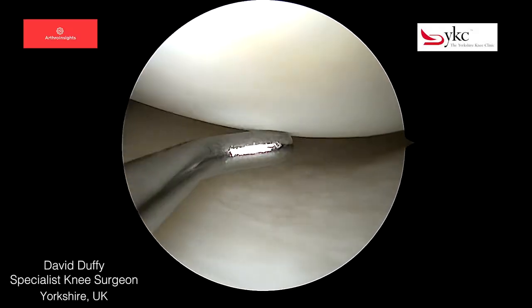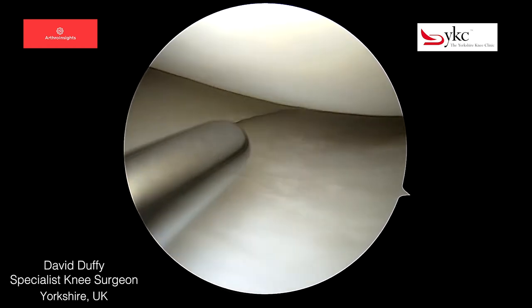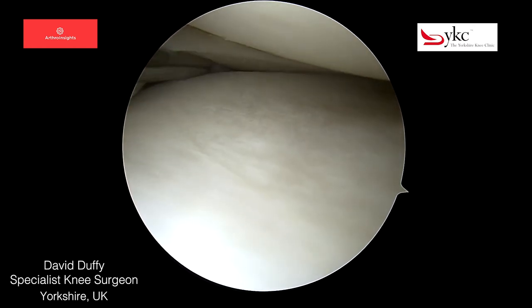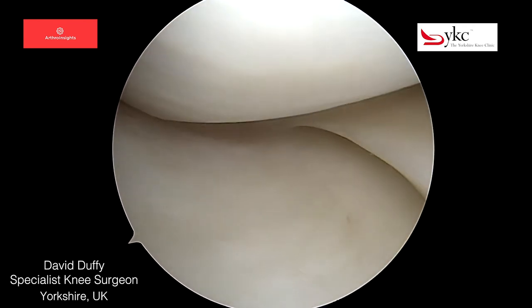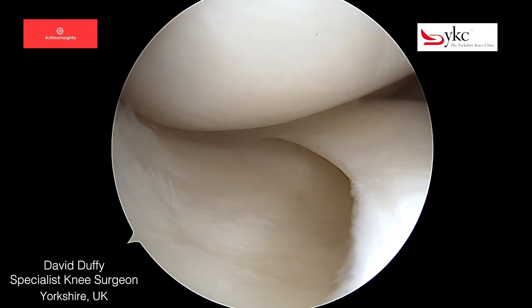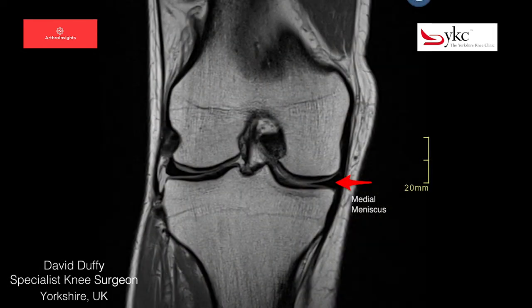The knee joint has three surfaces: the articular cartilage of the femur, the tibia, and a semicircular structure between the two called the meniscus. There are two menisci in the joint, one medial and one lateral. They act like shock absorbers, allowing any load to spread evenly throughout the joint. On this coronal T1 image, a normal meniscus is highlighted.